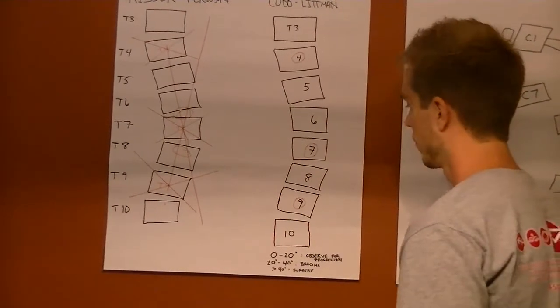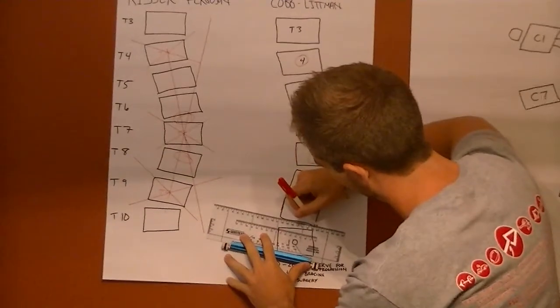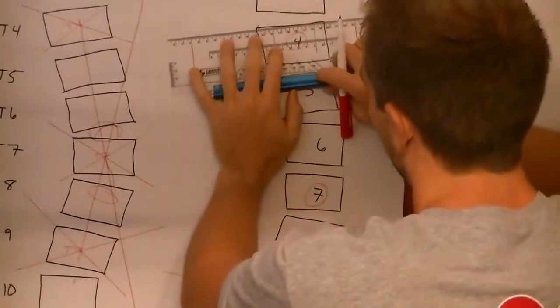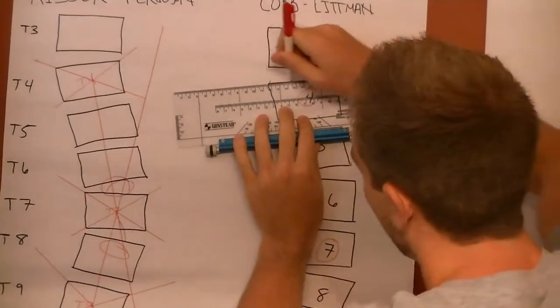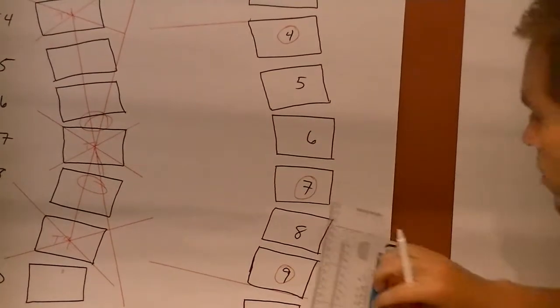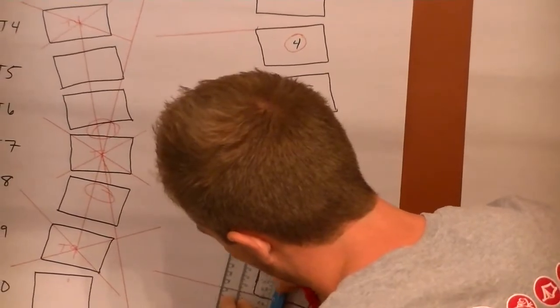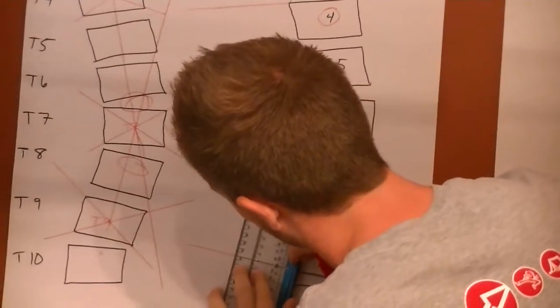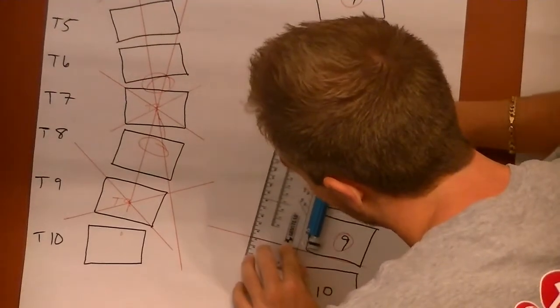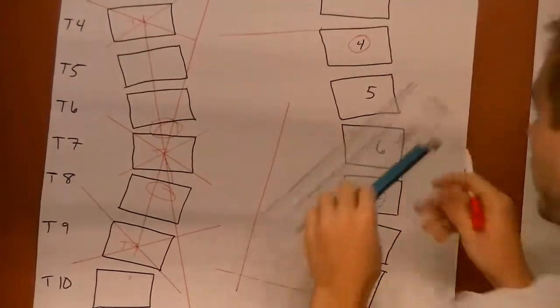From here, we're going to draw a line on the concave side, on the inferiormost aspect of the inferior vertebra. On the superior vertebra, you draw a line on the superior aspect of the vertebral body, going in towards the concavity. Then we're going to measure these lines by drawing a perpendicular line out. Just with the rolling ruler, take it from the body and draw a line out. I'm going to have to do it a little differently because this is a lot bigger than a normal spine. So draw that perpendicular line out, and do the same thing here.